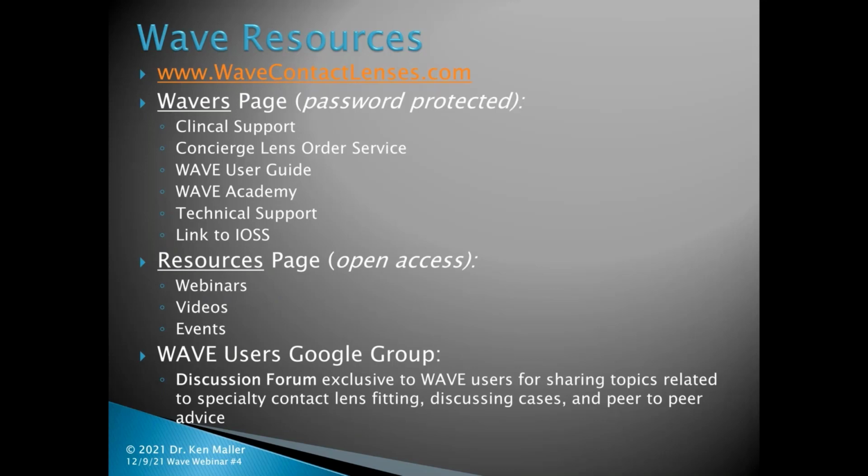For example, let's say we took that first case where I designed that R-Sym lens that was very successful for that very established wearer, and we did a freeform design because it was a little bit screwy in terms of the distribution of curves. Typically, you can end up with oddball optics that don't really work quite right. You will end up with variable performance. You can end up with malpositioning.